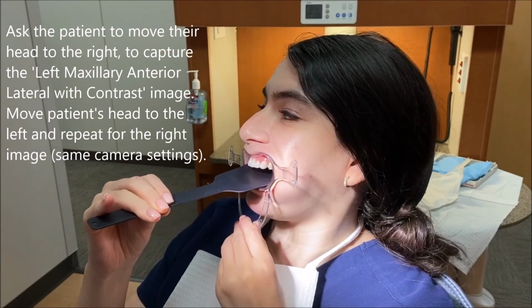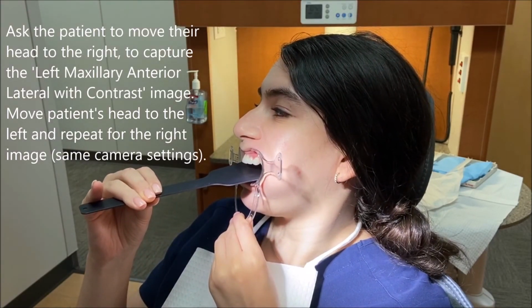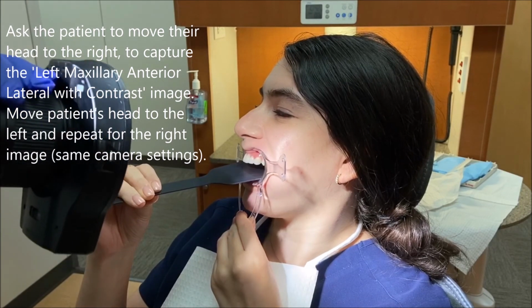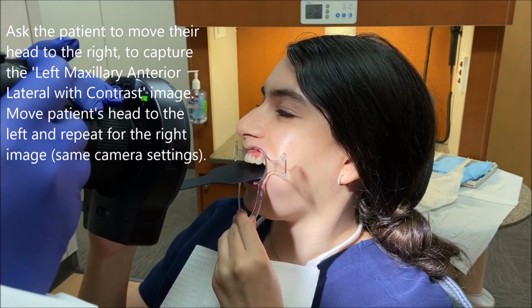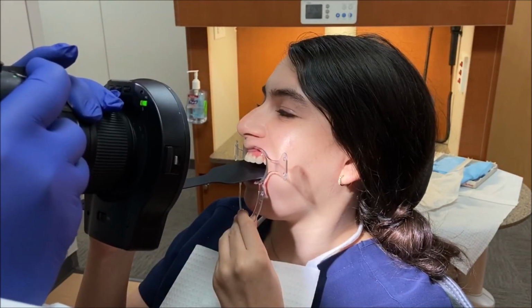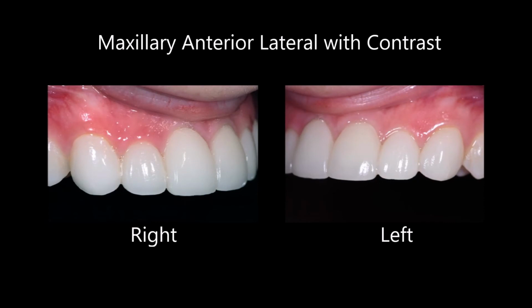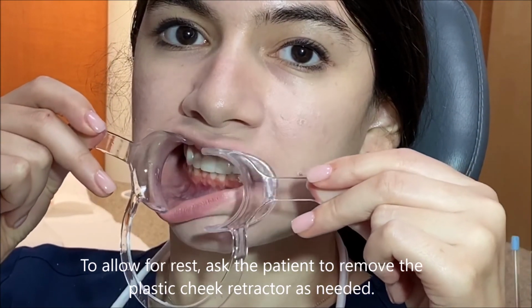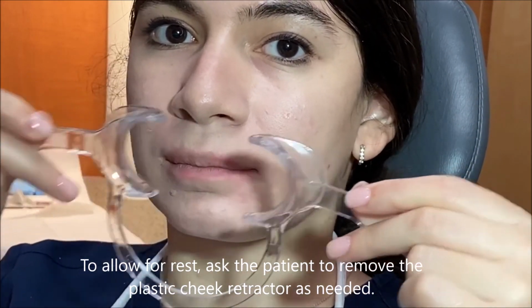Ask the patient to move their head to the right to capture the left maxillary anterior lateral with contrast image. Move patient's head to the left and repeat for the right image, same camera settings. Maxillary anterior lateral with contrast, right and left. To allow for rest, ask the patient to remove the plastic cheek retractor as needed.